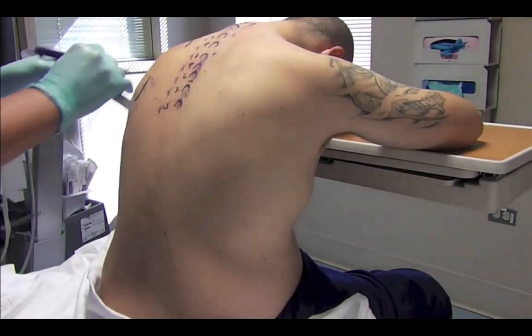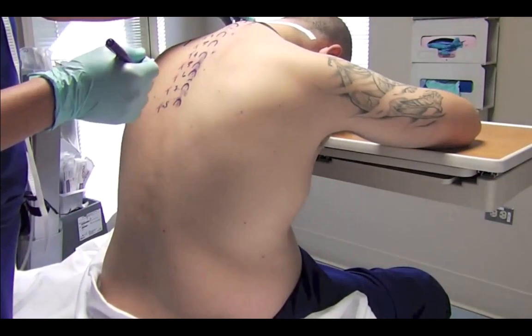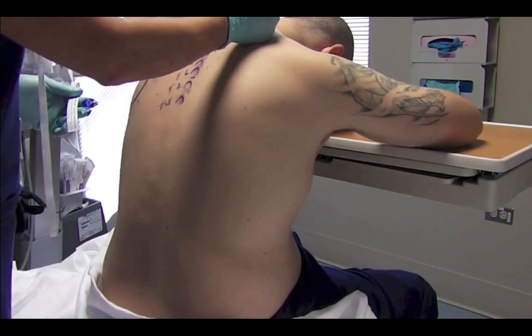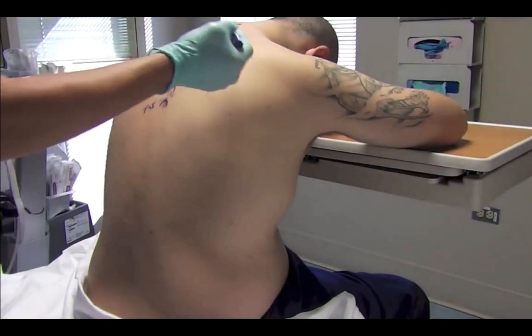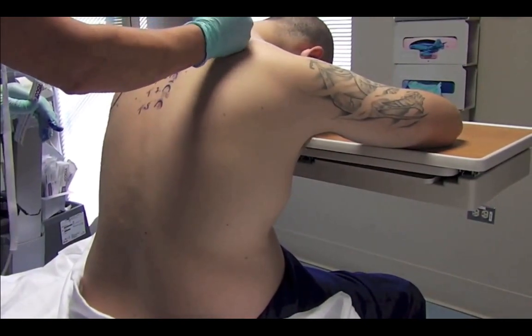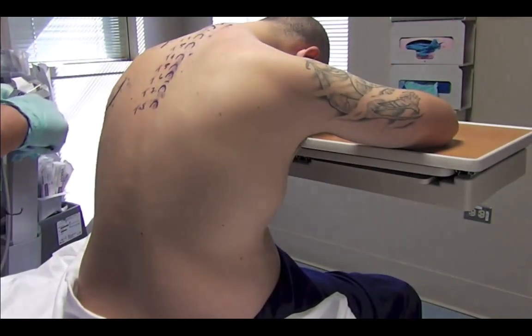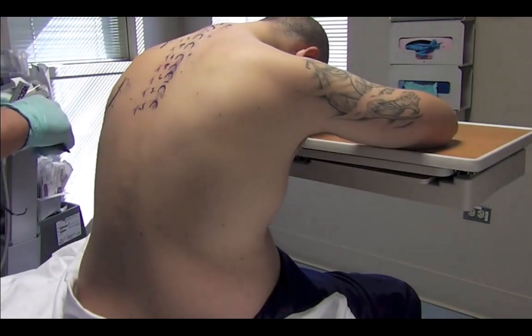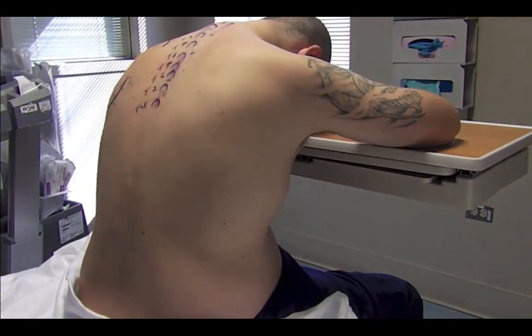For the placement of the block, if you're not using ultrasound, you take a ruler and measure 2.5 centimeters lateral to the midline on the side that you're doing the block and mark out that space. I've done that here for C7, T2, and T4. When we first started doing blocks at Stanford Hospital, we would do single-shot injections blindly at C7, T2, and T4. Now that we've gotten a little more sophisticated, we do a single injection basically in the middle of the dermatome where we want the best coverage, and we place a catheter there. We do, however, use ultrasound for all of our blocks. We still, however, mark the patients.